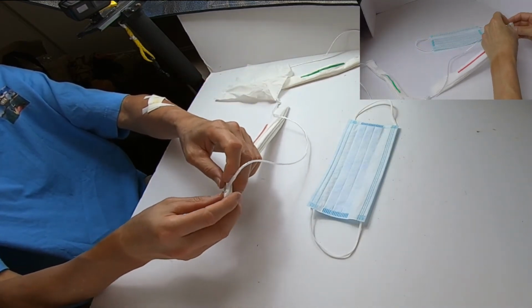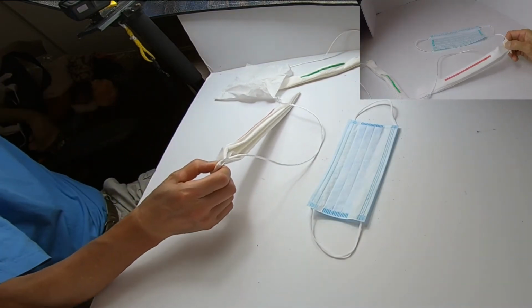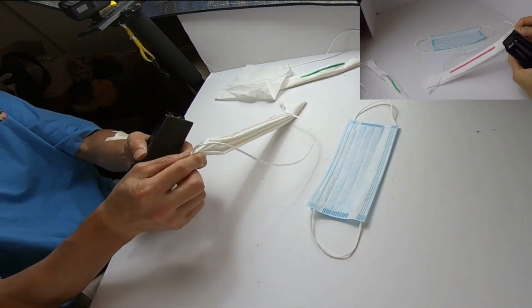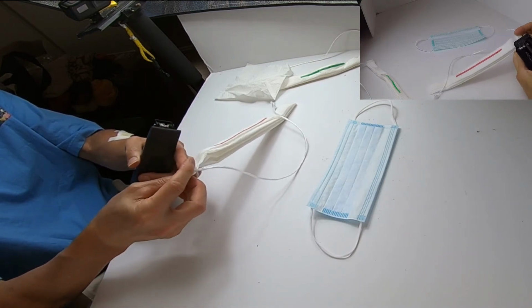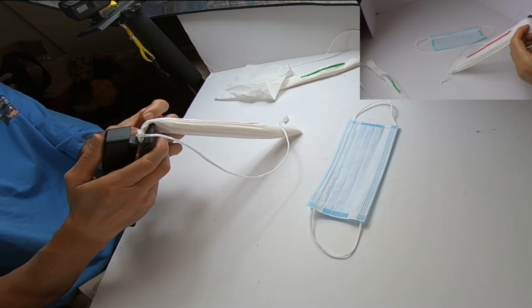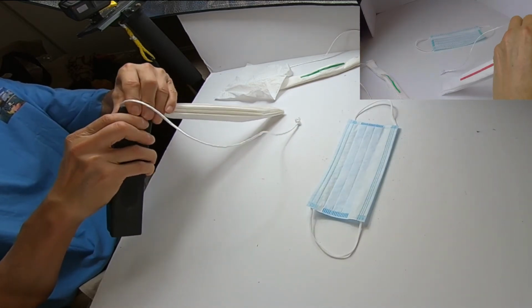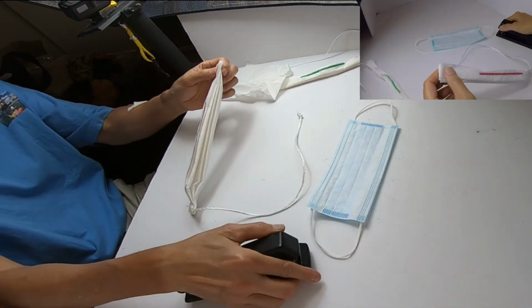So the next step is to simply turn this over and reach back here and get my stapler. Now the critical step here is you want to staple above the knot, like so. And then go to the other side and do the same.